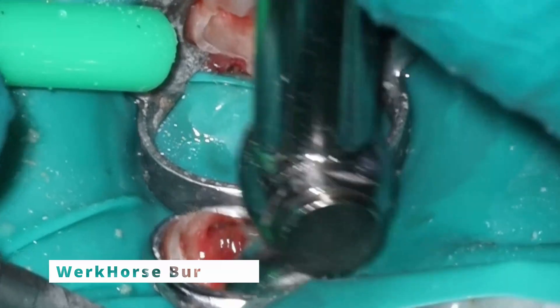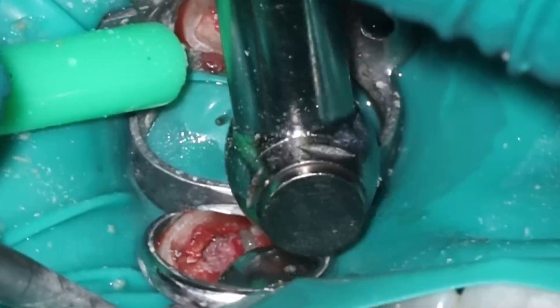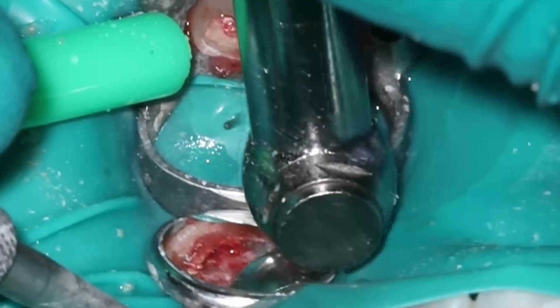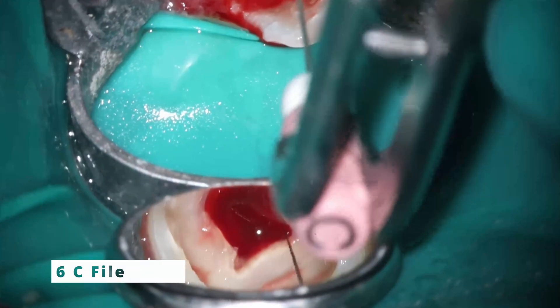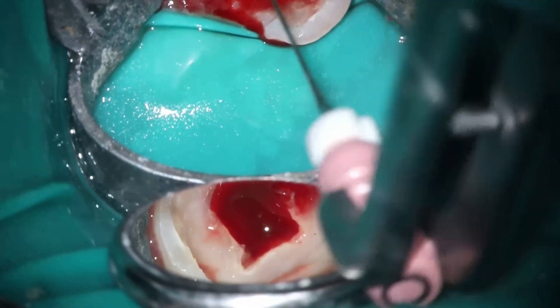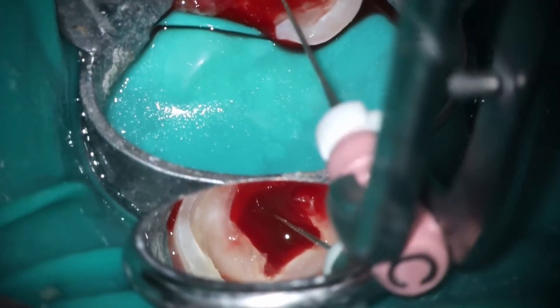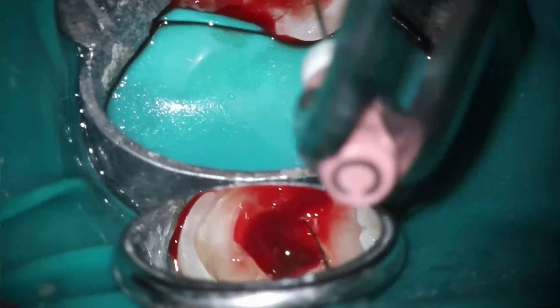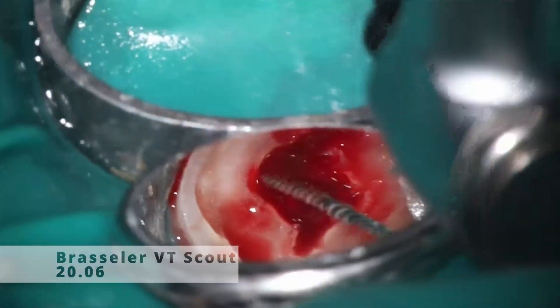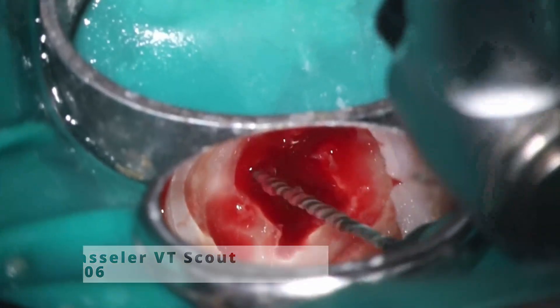We're going to start off with my workhorse burr. With the access here, you saw how far I had to go to the lingual to pick that up. You'll notice this is what I was talking about — it's not symmetrical in this sort of case. Another thing: your distal lingual in these Radix cases almost always has severe curves. They're very skinny as well, and so you have to approach these almost like a curved canal.